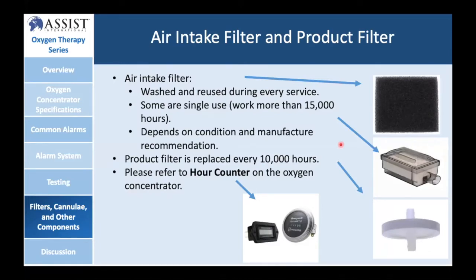I want to end my portion of the presentation with just a quick talk about the filters. The oxygen concentrator has multiple filters on them. One of the filters, which is the air intake filter, this right here, is the filter that I had pointed out in the picture of the diagram of the oxygen concentrator. This filter can be cleaned and must be cleaned. It can be washed and must be washed. This is very critical to make sure that there's good flow of air into the unit.